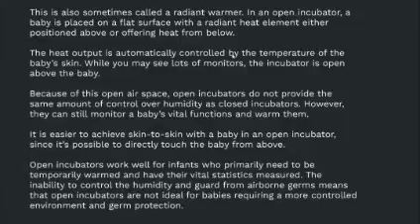Open incubators work well for infants who primarily need to be temporarily warmed and have their vital statistics measured. For example, after birth, the baby is not given to the mother if he or she is found unstable. It is moved to an open incubator till the vitals and everything are normal again.